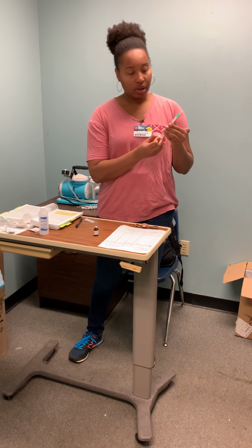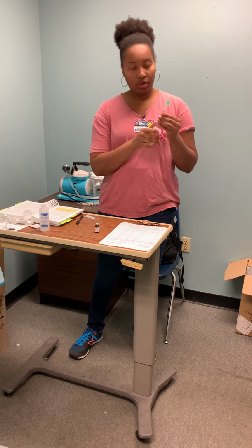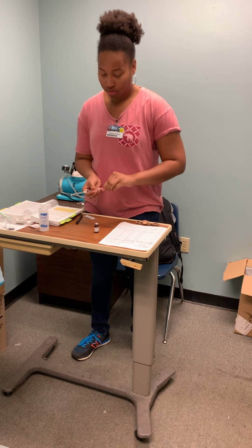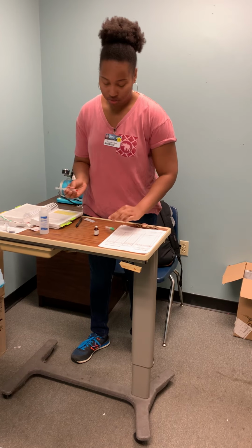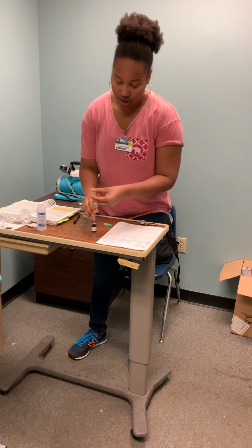I'll draw 3 milliliters of air to avoid any type of air bubbles. I'll then inject air.